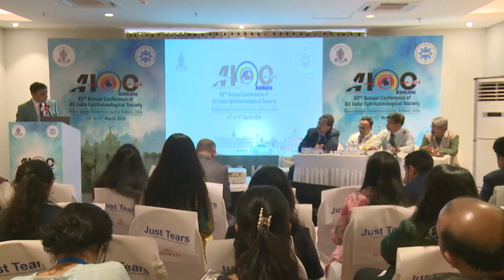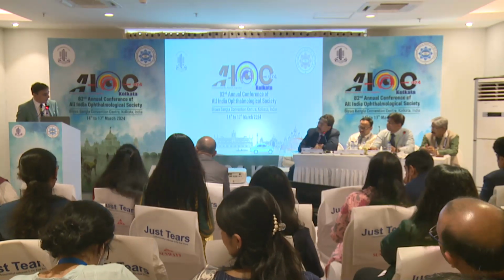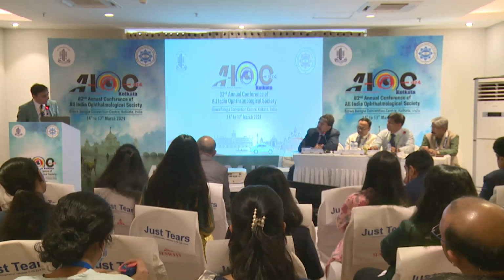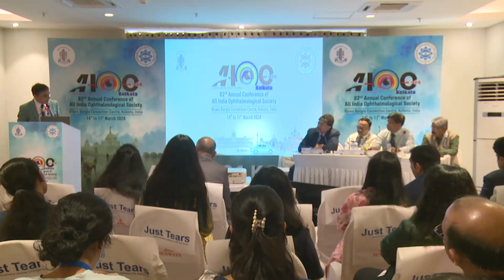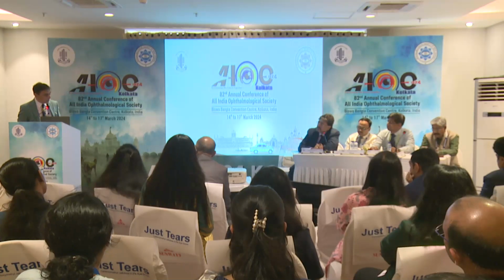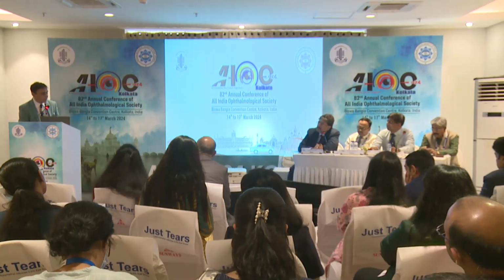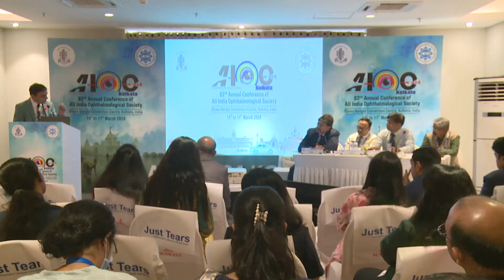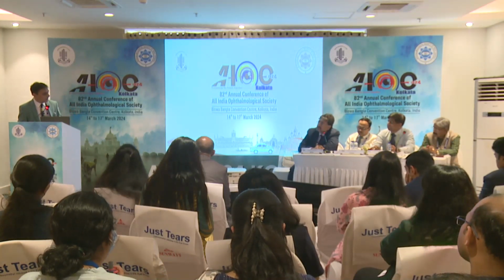Right. So sometimes now I've become a little smarter. If you have a doubt that this CCC may not be complete, I'll first use a dye and then check the CCC and then go around. Now sometimes if it is not complete, like sometimes the RK cuts are very dense, in that area you may not find it, then you do a manual CCC in that area, go beyond the applied laser, and that will make sure that your CCC is strong enough and it doesn't give way.